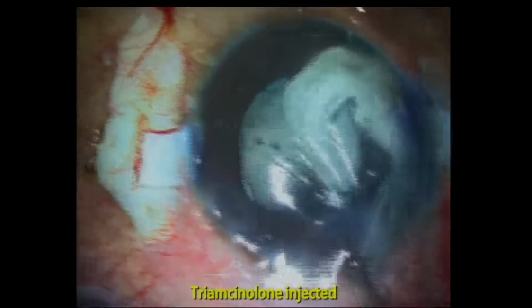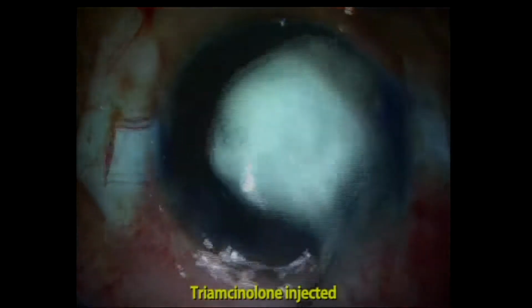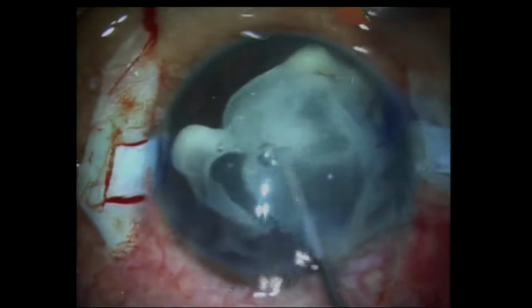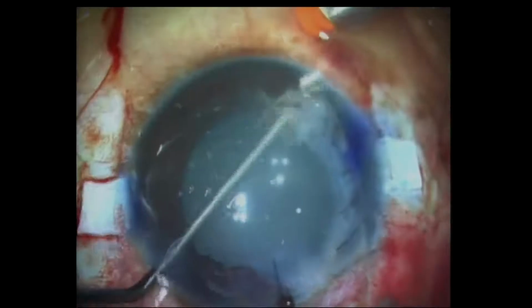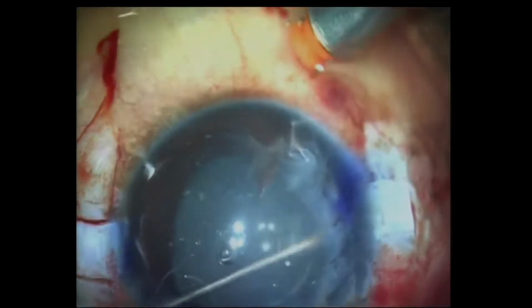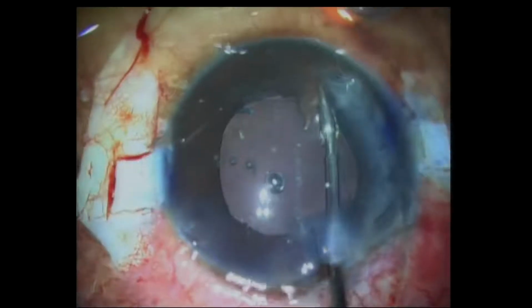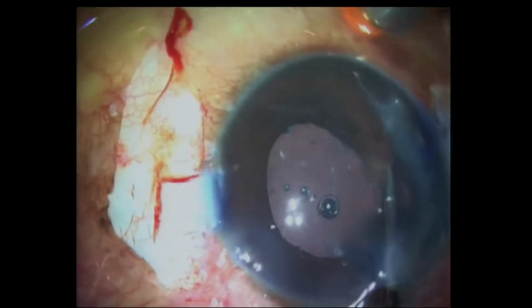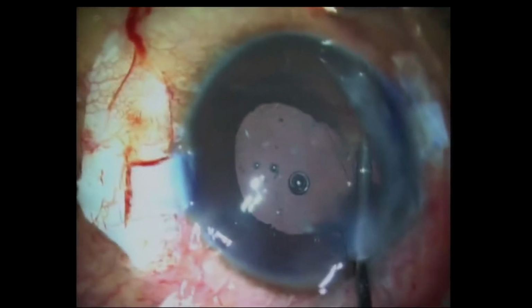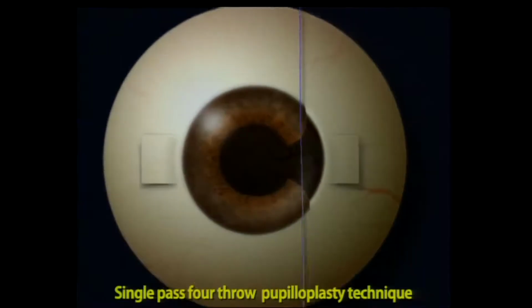Now, I've put some triamcinolone to check if there's any vitreous in the anterior chamber. Fortunately, there was not much. But more importantly, now I have close to 180 degrees of iris tear. If you see, there's an iridodialysis, there's an iris root tear, and there is a pupillary tear. So it's a complete all-around wound.